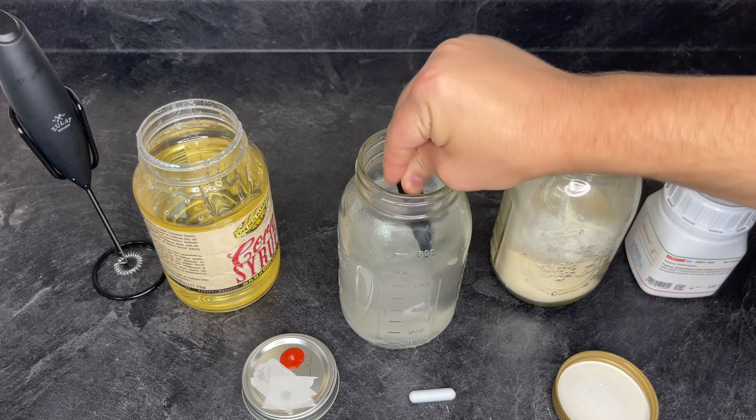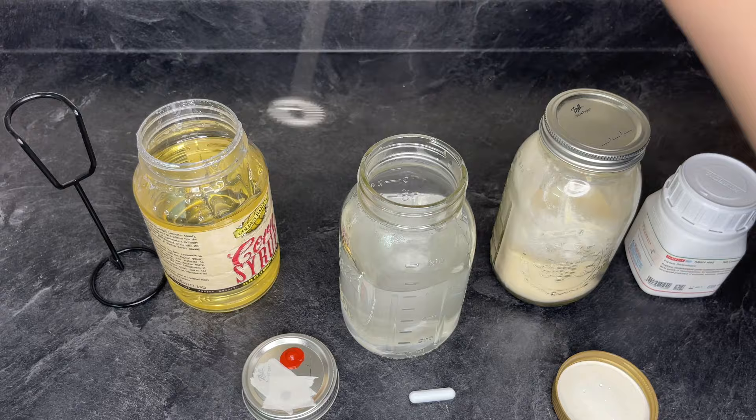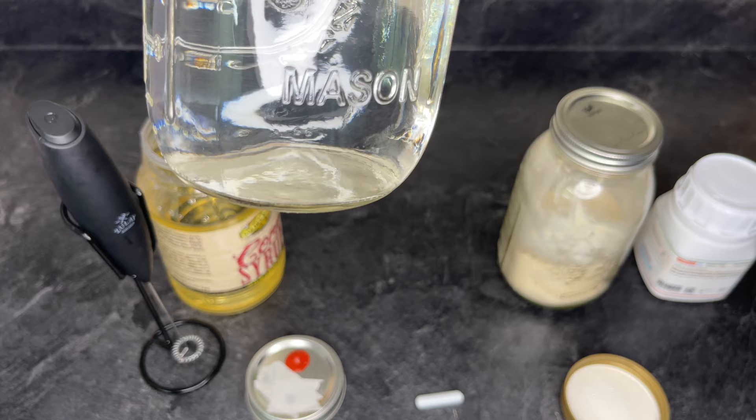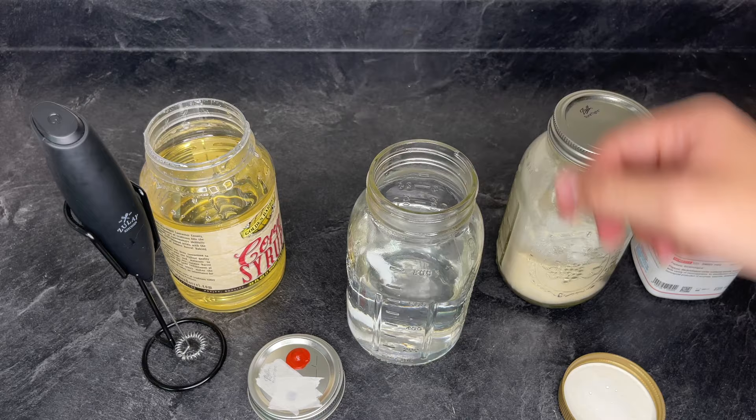I found it helpful to use this hand-held frother to mix up the solution. After all the ingredients have been mixed into the solution, I check to make sure there's no sediment and then I add a magnetic stir bar and my modified jar lid.